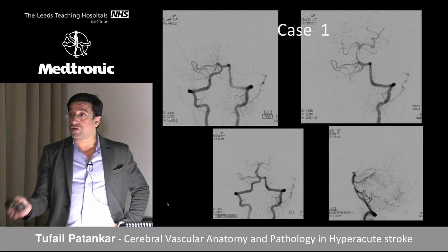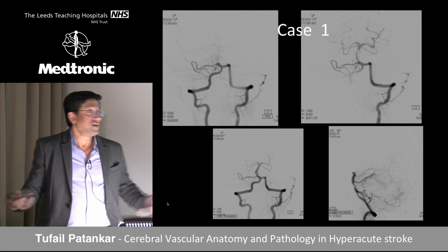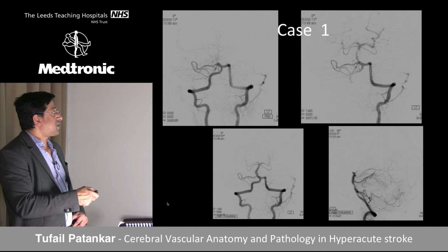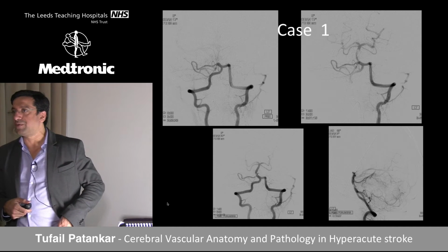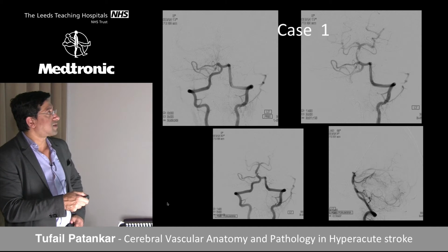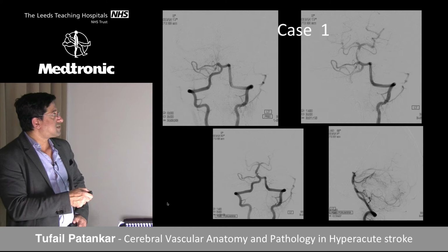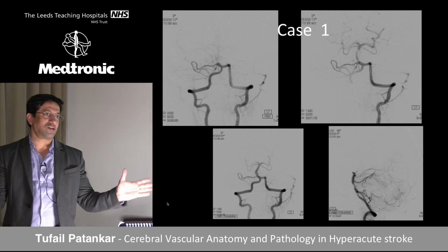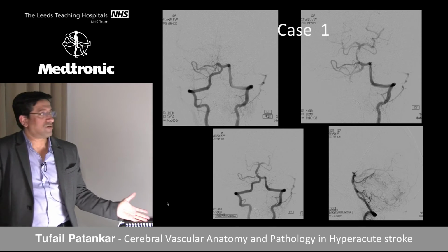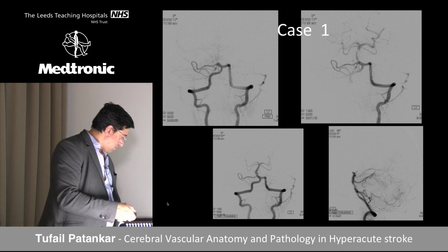The boy was a 4-year-old presenting with a stroke. How many of you have seen that? A 4-year-old boy. You can see the vertebral artery, and by the time he came here, he was intubated. You can see there is a clot here, and then I used the Solitaire and took the clot out. This is not difficult. This is the vertebral artery, the basilar is clot. That's one artery you need to know. The other artery is internal carotid with MCA and ACA. Not different. You can see that I've opened up. There was no flow here, and no flow here.